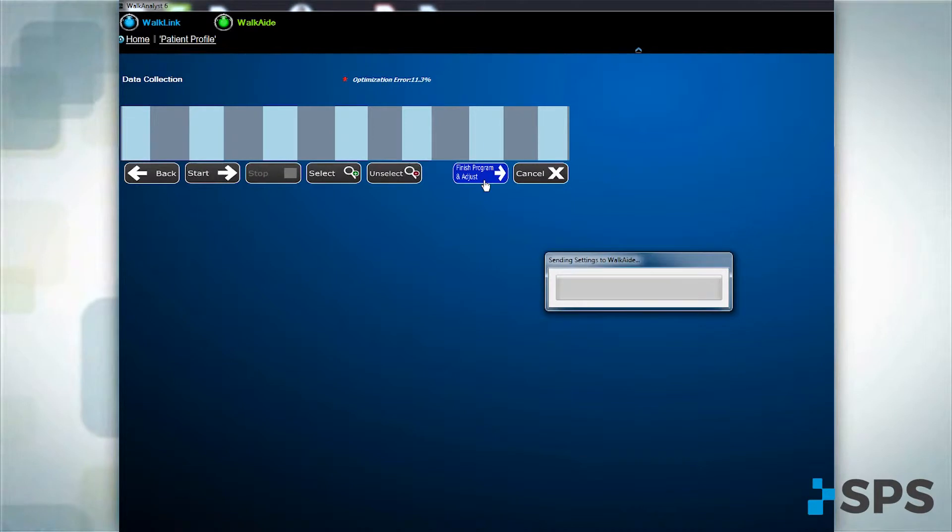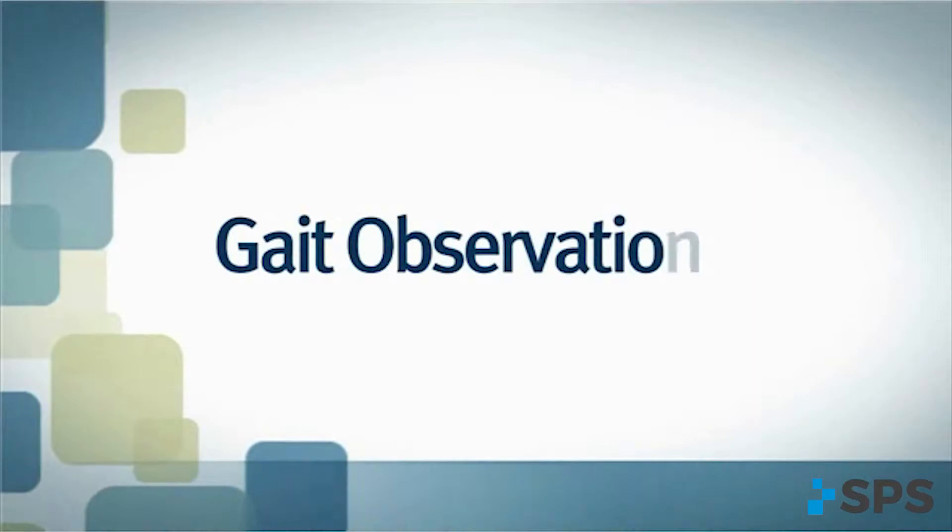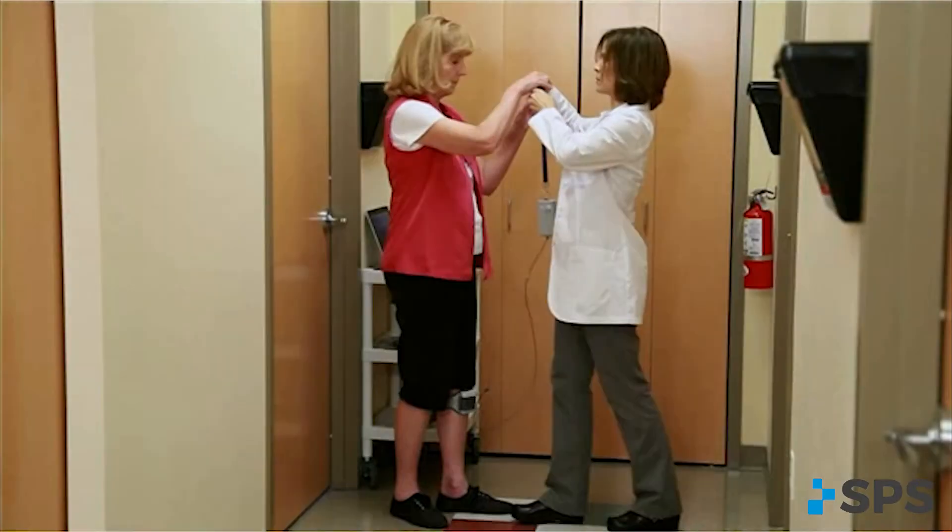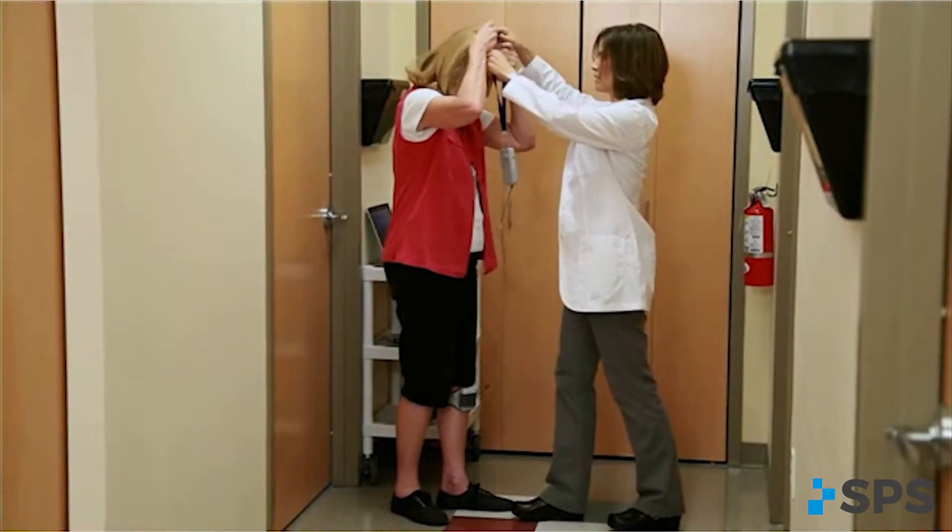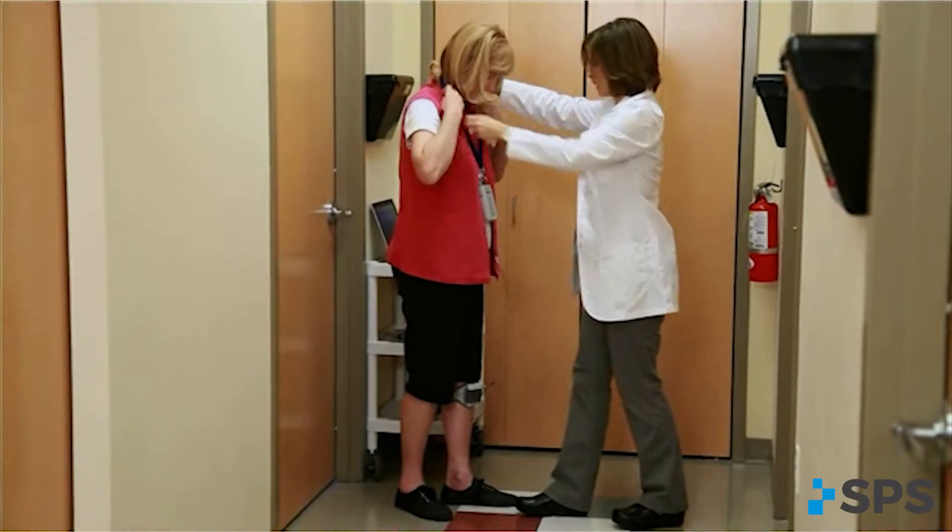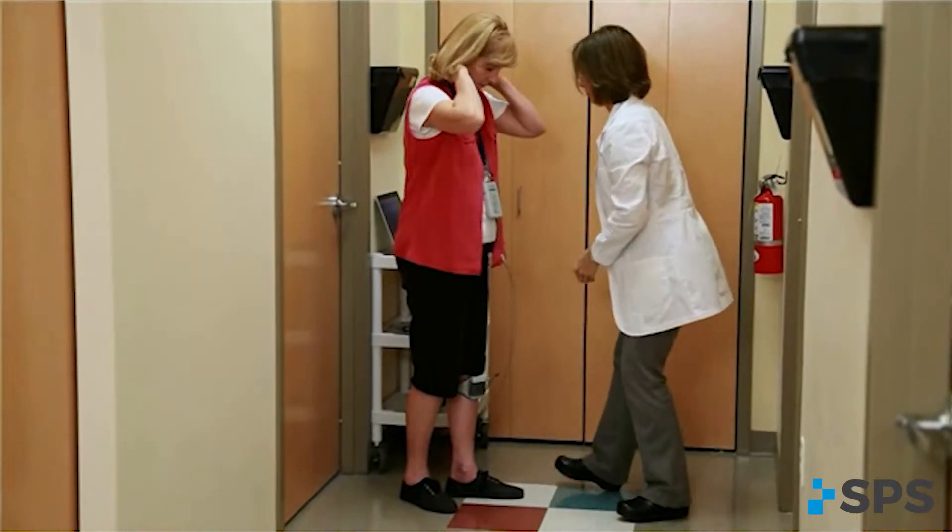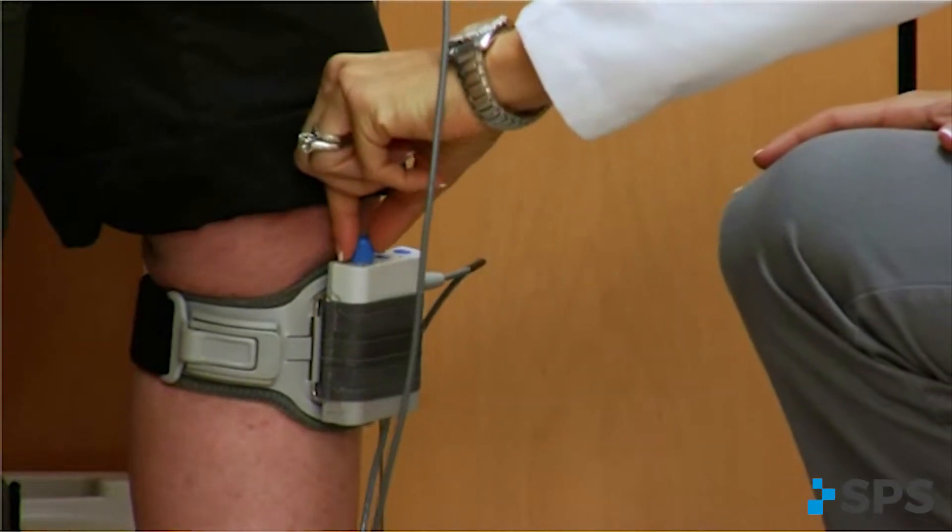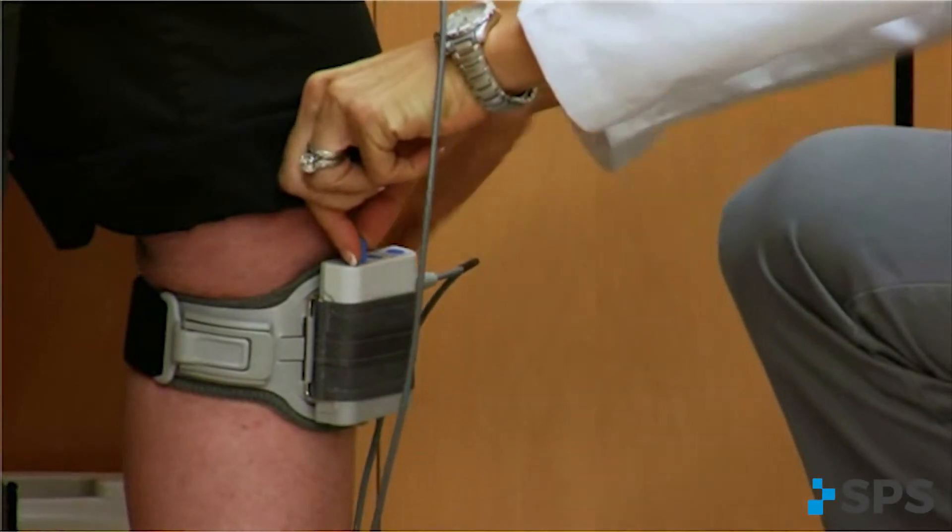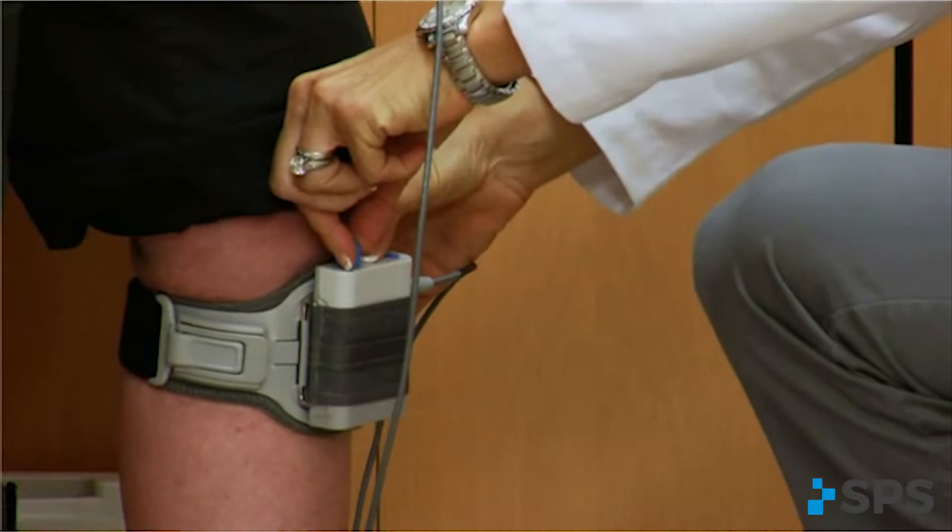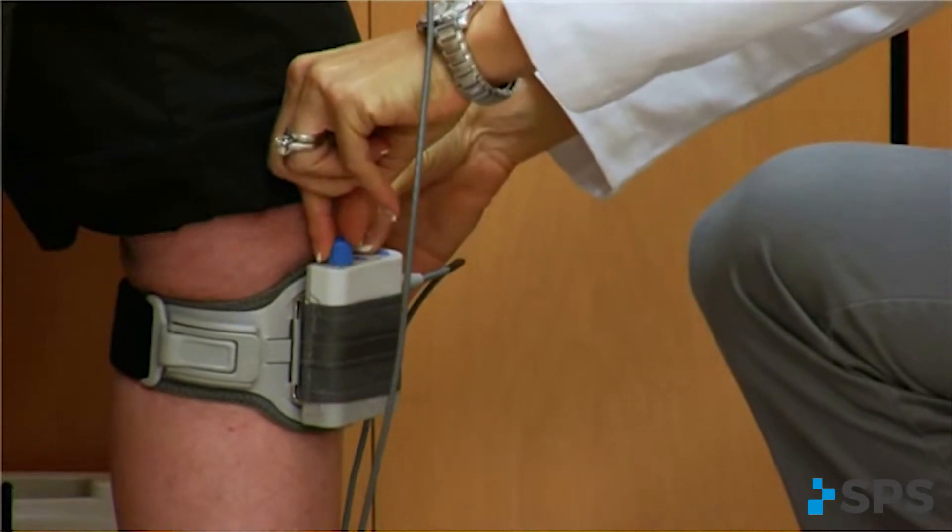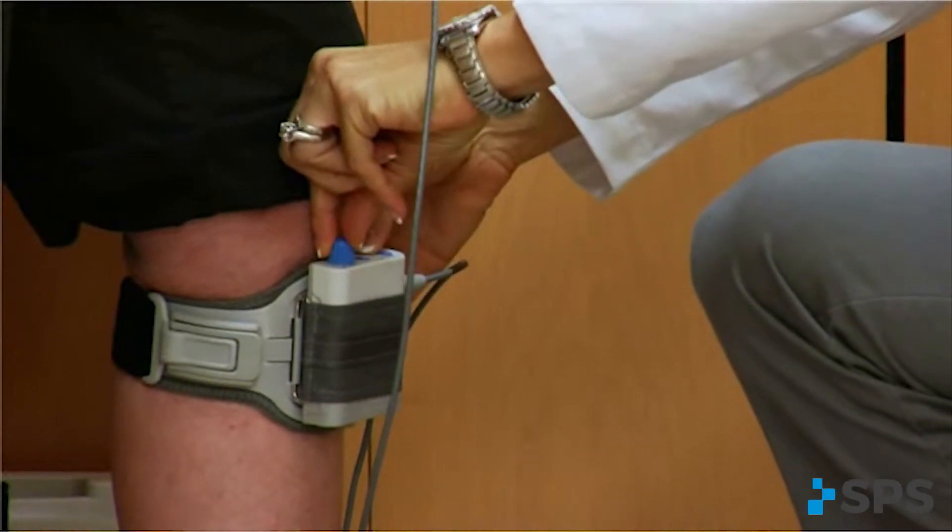You will hear a beep which indicates that the program has been sent successfully. Next, place the WalkLink around the patient's neck. On the WalkAid, set the audible beep so that while you watch the patient walk, you will be able to hear the stimulation occurring.